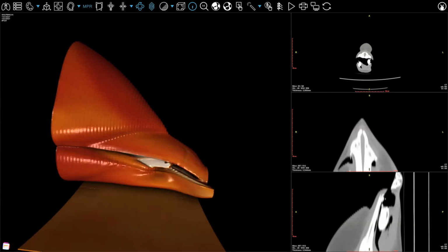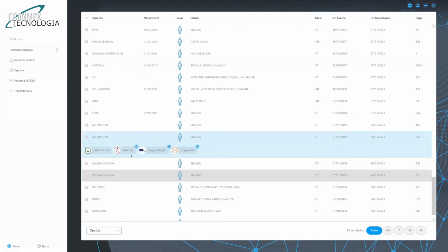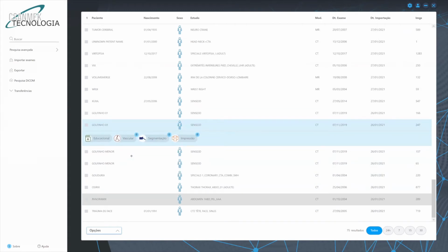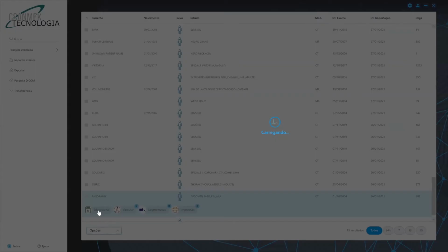And interestingly, we could see the oil inside the animal, which was not the cause of death, but we were able to detect it in the 3D reconstruction. So this is just a summary to say we can have animal and human reconstructions, and for animals we also have the atlas. We'll show that in a second.